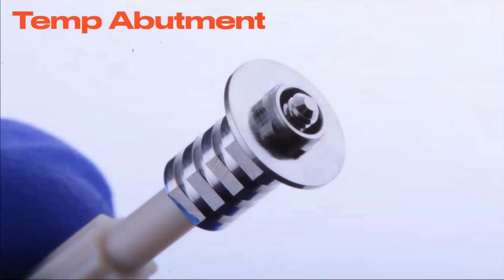And so we torque that in, and then we've got our temporary abutment. We've got an abutment that allows us to put something in and then torque it down, and then allow us to really spend the time and get to it.